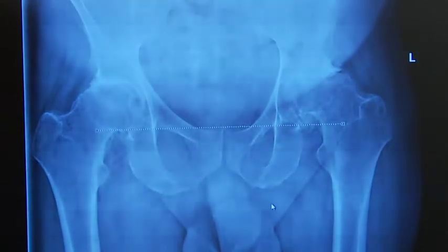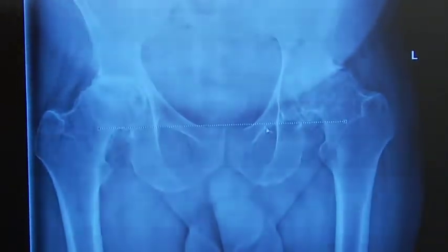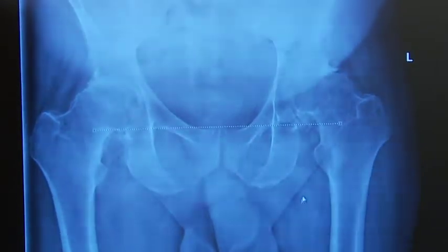So he's more of an inlet rather than a mix of an inlet and outlet, and he's definitely not an outlet pelvis. And you can see that he looks like an inlet pelvis, as you can see right into his pelvis quite well. And so this line helps us intraoperatively, again, using the grid and fluoroscopy. We'll try to simulate that position.